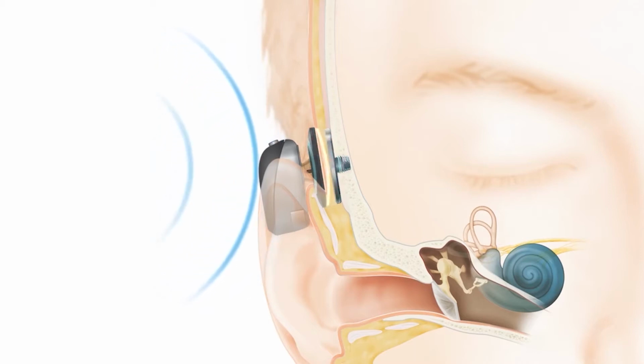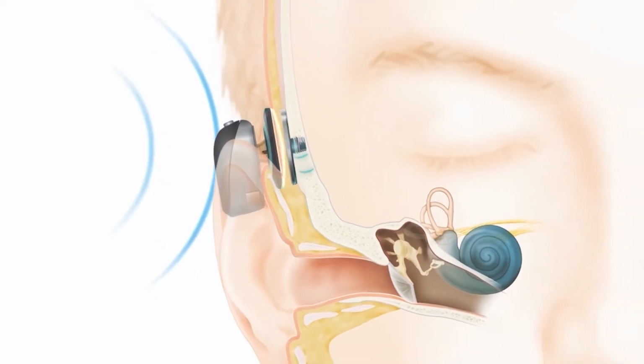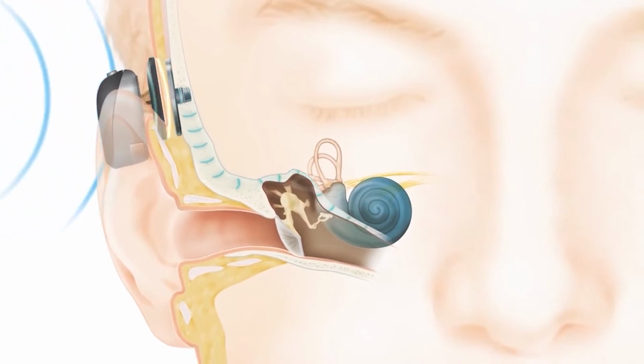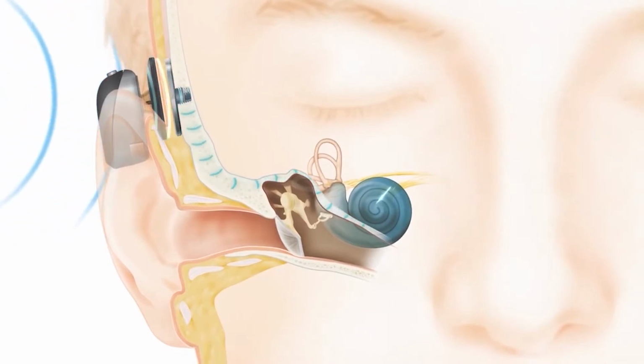And by stimulating the bones in the skull and leveraging the bone conduction pathway, typically a lot of those patients, particularly in that microtia atresia space, have very normal functioning cochlea. And the idea is that if you can vibrate that pathway and move the signal beyond that, you get a very efficient way to couple the acoustic amplification. In this case, it's just enough to get through the bone and stimulate the hair cells in their natural state. And that's a big plus for that type of person.